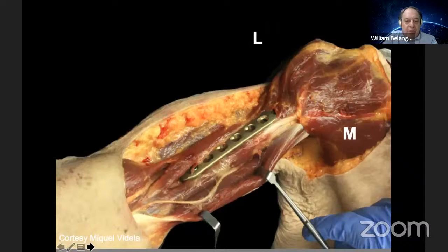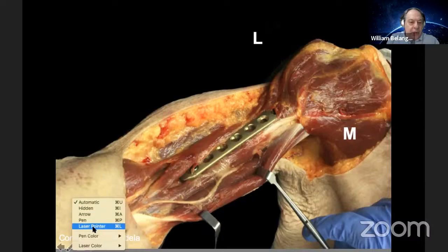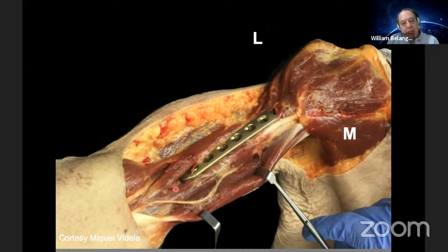This is an anatomic view. You can see here, let me use the pointer laser. You can see here the brachialis is split. This is the plate, it's a cadaveric specimen. This is the musculocutaneous nerve, and the radial nerve is here. Okay.